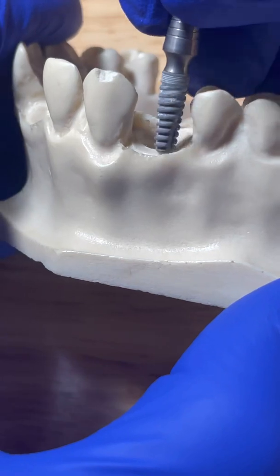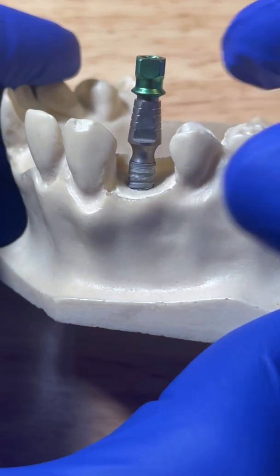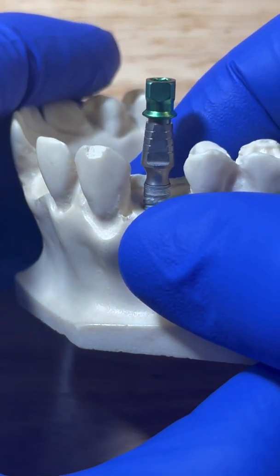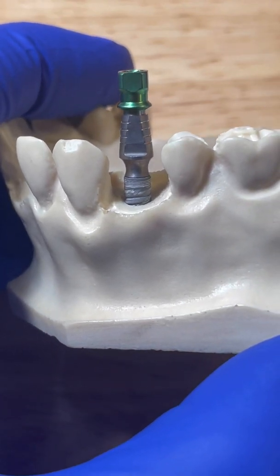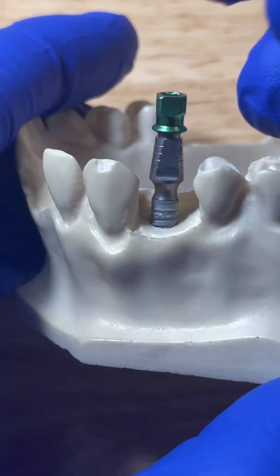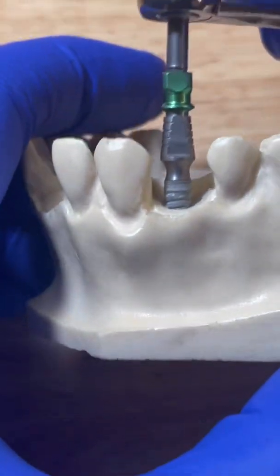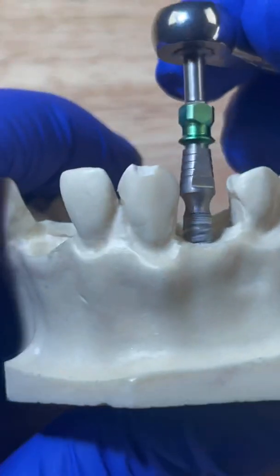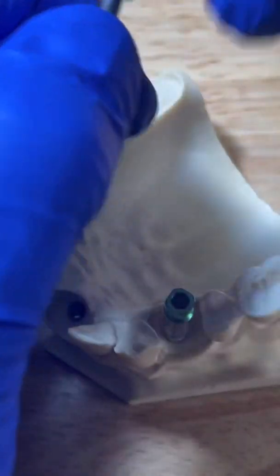But there's another option — option number two. If when you're originally placing your implant it's pretty tight, but not so tight that you feel you're going to break something. After a while of doing enough implant surgeries, you'll get a good feel for what 35 newton centimeters feels like, what 40 feels like, what 80 feels like. So if it's still going in and you're not going above 60, what you can do is still place it, but you'll do two rotations in and then one rotation out.